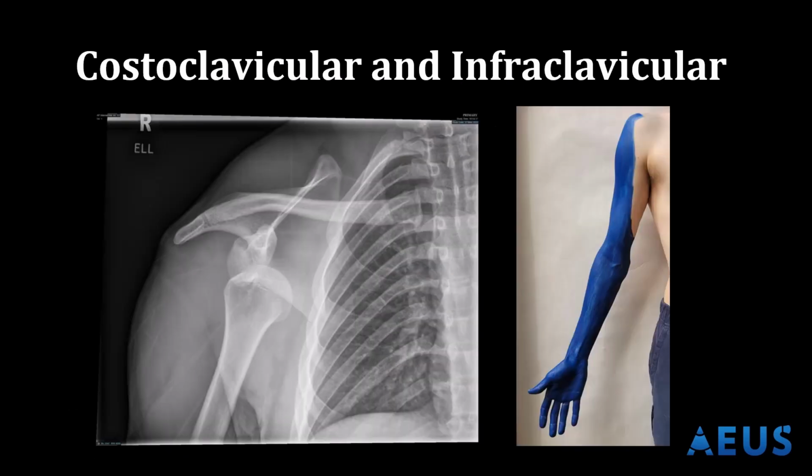For our third potential choice of nerve block, I've combined the infraclavicular and costoclavicular blocks since they are pretty closely related. The costoclavicular brachial plexus block targets the brachial plexus at the level of the cords, but before they split to array around the axillary artery, while they still lie lateral to the axillary artery.